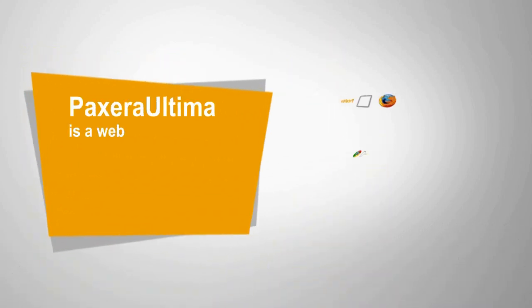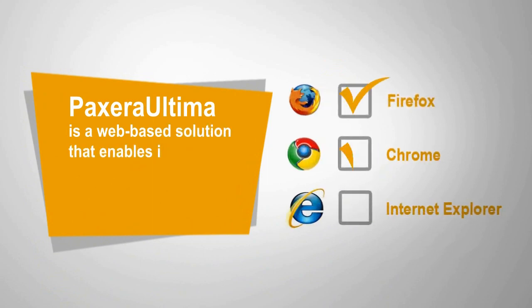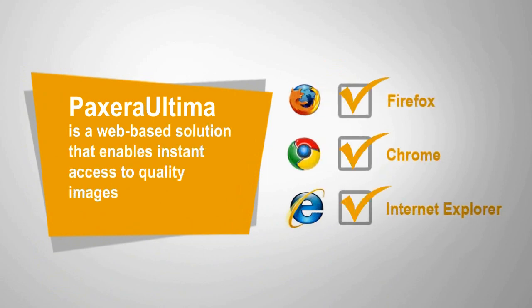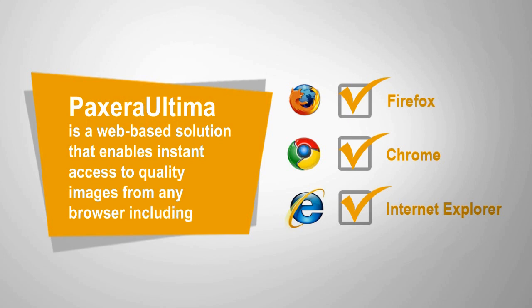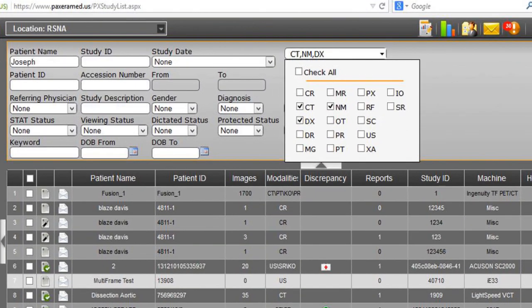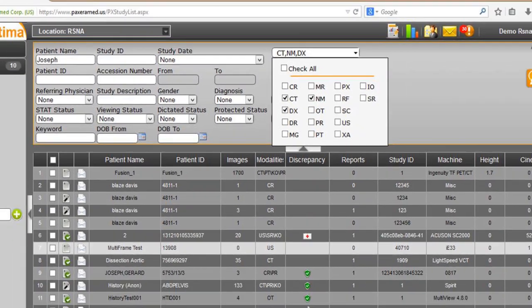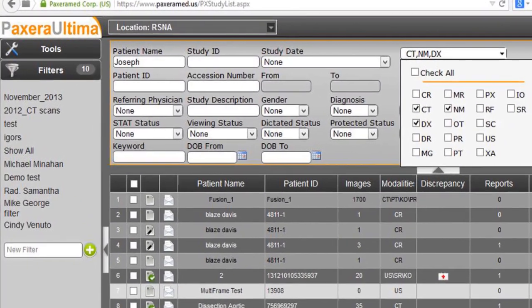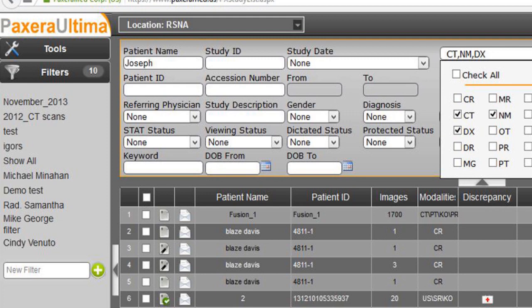Paxera Ultima is a web-based solution that enables instant access to quality images from any browser. From the Worklist screen, users can search studies in seconds through an array of filters — from the patient name, modality type, referring physician, or even study description or a keyword. Filters can be saved to speed up future searches.